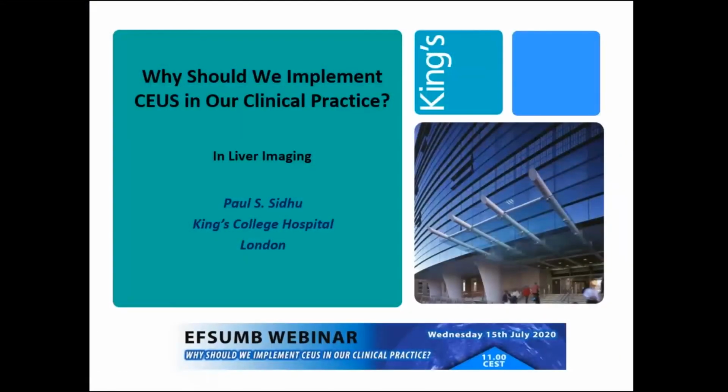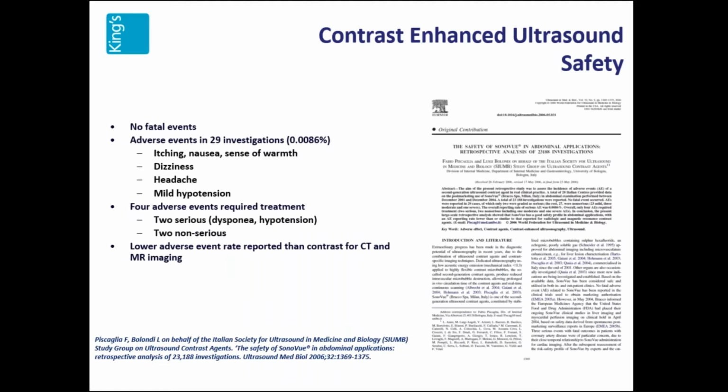what we're going to use here is in liver imaging. And I'm going to first talk to you about how safe it is to use contrast enhanced ultrasound, because we're all brought up with, as radiologists, that the diagnostic CT and MR has always been the way we're looking to use contrast, and ultrasound has always been without contrast enhancement. But this has all changed recently, and you'll see that the safety is beyond question.